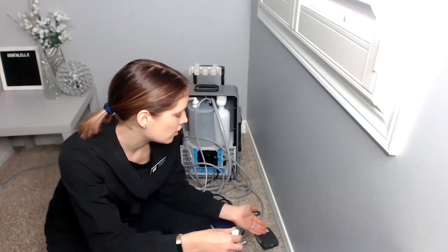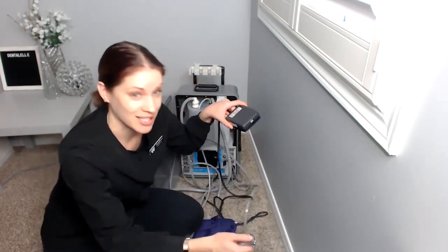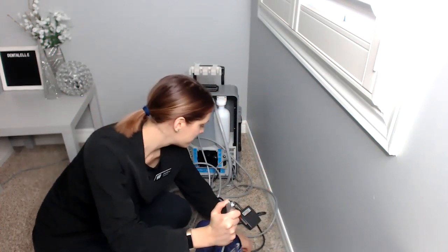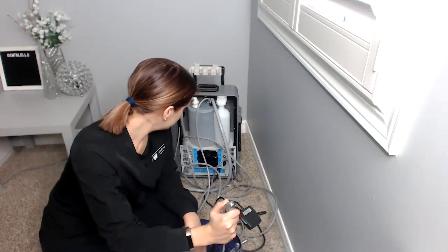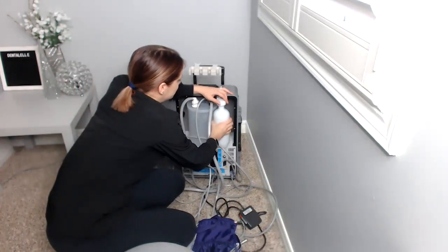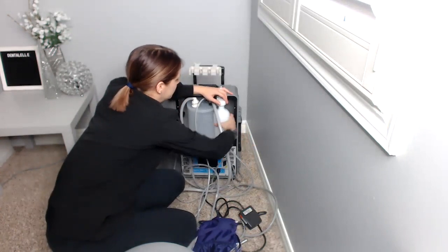I don't think it makes a big deal if you don't unplug it first, but just in case you step on the foot pedal and give yourself a heart attack, right? Because this actually turns it on. So let me just decompress the air a little bit more. There we go. I just kind of turn it a little bit. There, done.